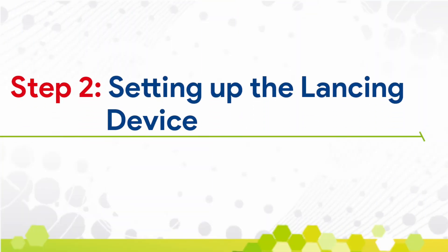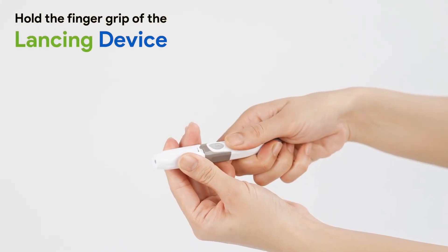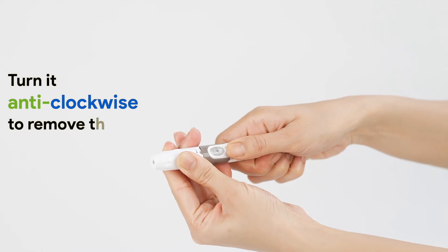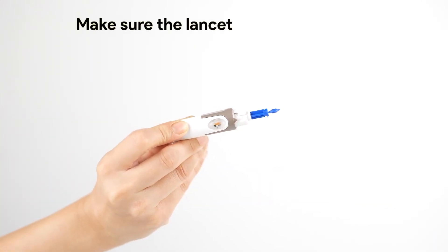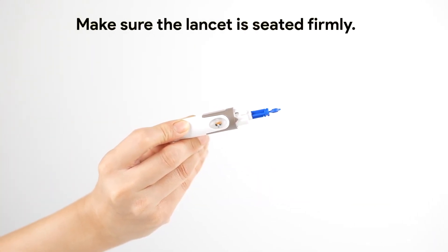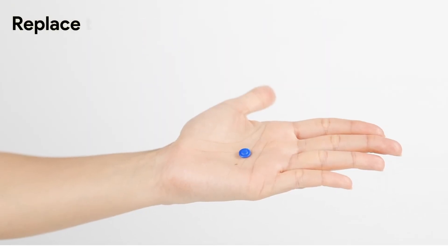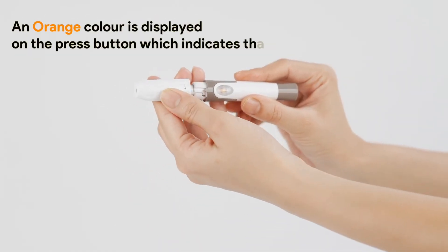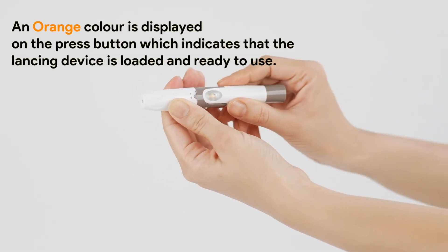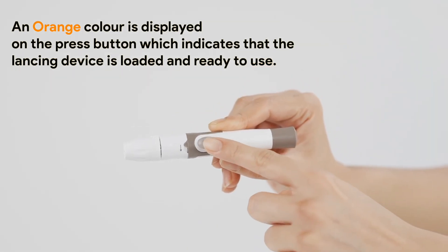Setting up the lancing device: hold the finger grip of the lancing device, then turn it anti-clockwise to remove the cap. Insert the lancet into the lancet holder. Make sure the lancet is seated firmly. Remove the protective cap and keep it aside. Replace the lancing device cap and screw it back. An orange color displayed on the press button indicates that the lancing device is loaded and ready to use.